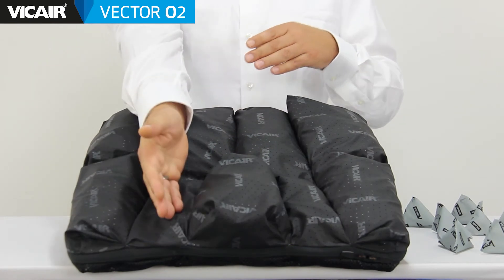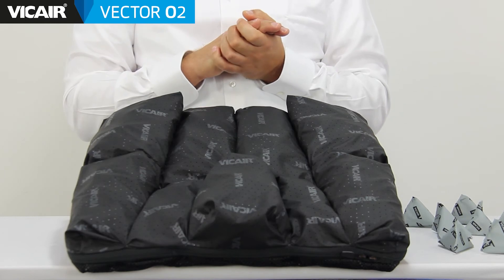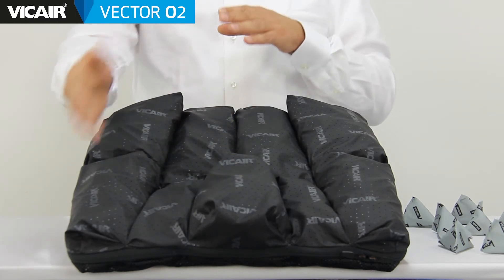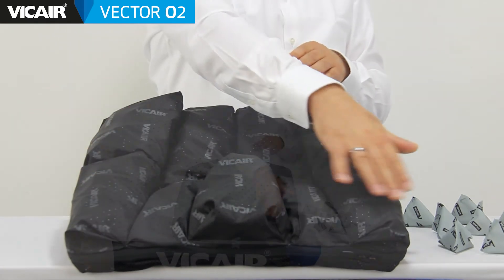The compartments under the right and left femur form a recess for proper alignment of the thighs. The middle compartment provides medial thigh support and the two side compartments lateral thigh support. Together these five compartments provide optimal leg guidance.